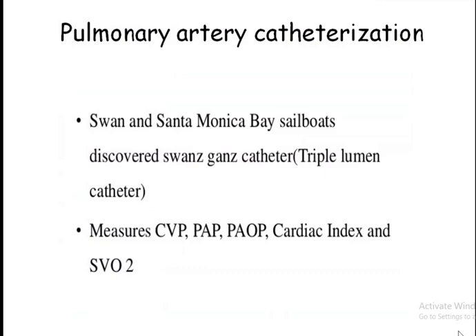Now, coming to the pulmonary artery catheterization. Nowadays we are not using it routinely, only very rarely in certain conditions. It is used in just a few conditions, because now we are doing it much better non-invasively with the help of echocardiography and other measures like measurement of the cardiac output with other techniques.